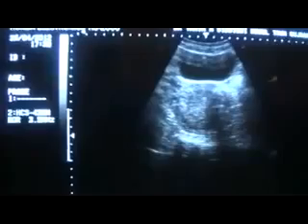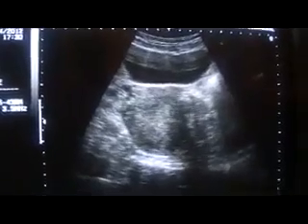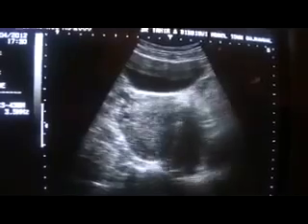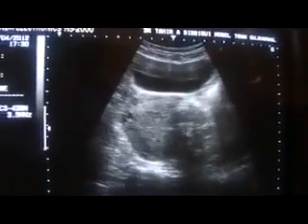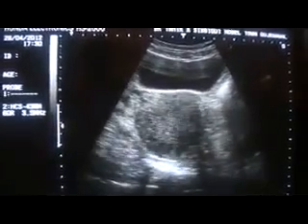Now, a pelvic ultrasound of a 40-year-old female, para, and she has come to rule out the possibility of fibroid, as she has been declared by some other place, not to mention.